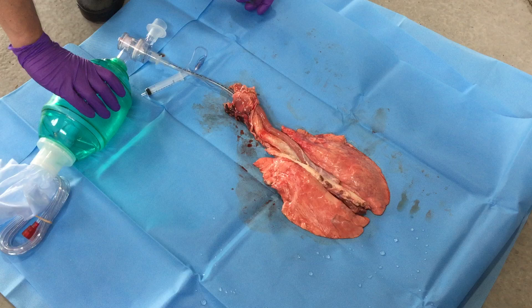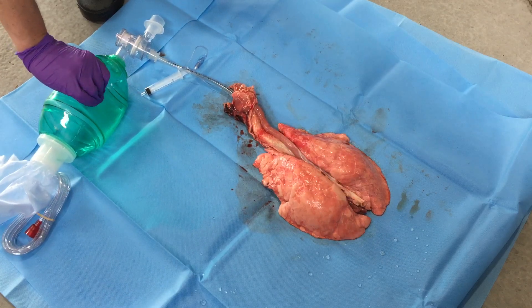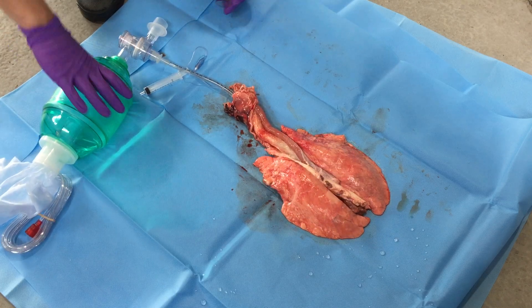Right now we're going to ventilate these lungs — that hopefully don't look like yours — with a regular BVM. You can see each time we bag they completely deflate. All that increased work.